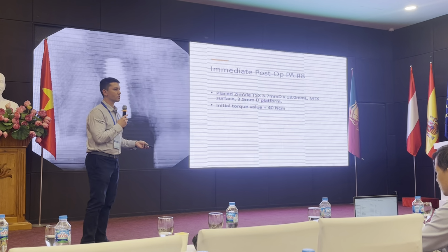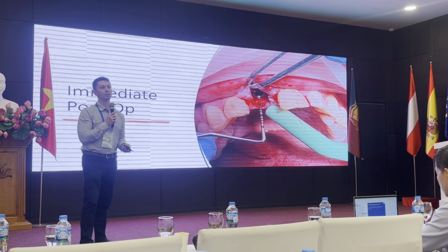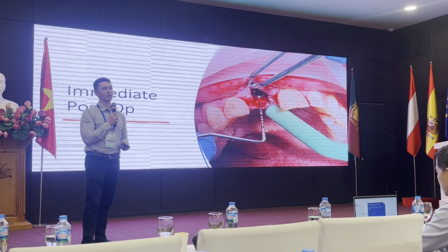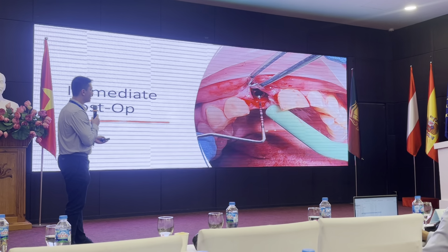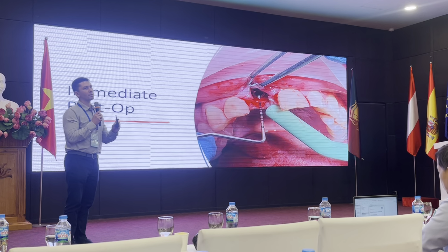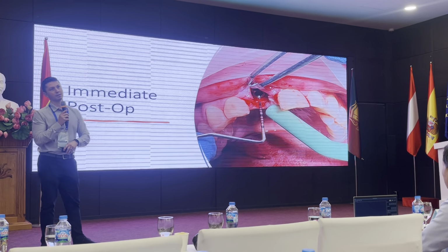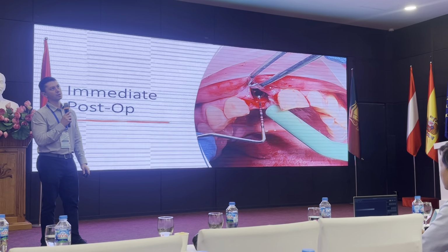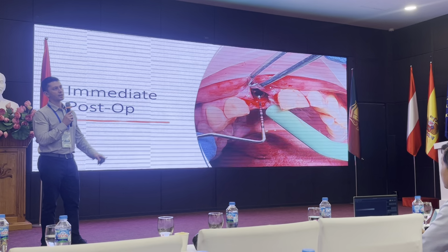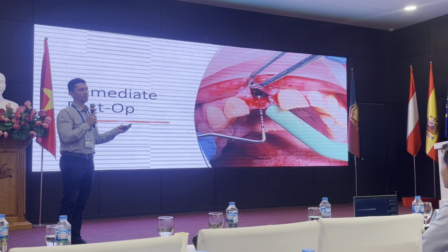So this procedure could have easily taken maybe an hour, hour and a half, if we're really not sure how to do the surgery. Because we would place the implant, check the angle, oh, maybe we're too facial, too buccal, take out the implant, drill again, check the angle, oh, we're not at the right angle, take out the implant, drill again, put the implant in, check the angle.